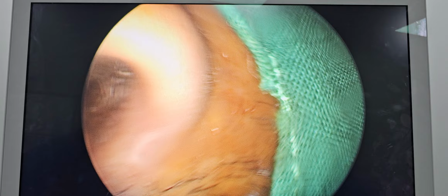And this side, let's see our left side. So the left nostril also, here you can see the polyp. This also seems to have originated from the frontal sinus. So let's see how it goes. Our planning is to do the full house, and here you can see the perforation, a subtle perforation already. You can see a small subtle perforation.